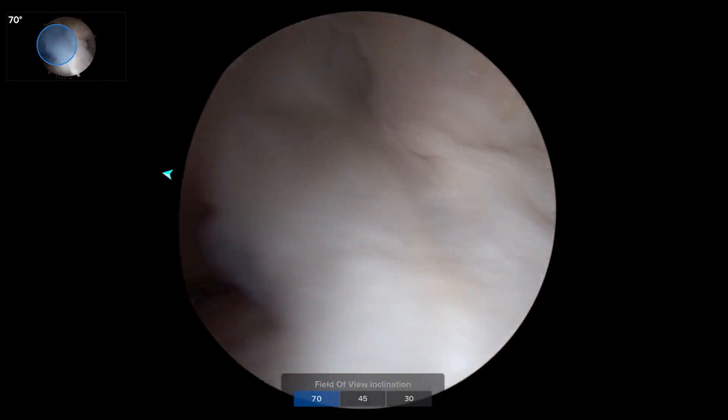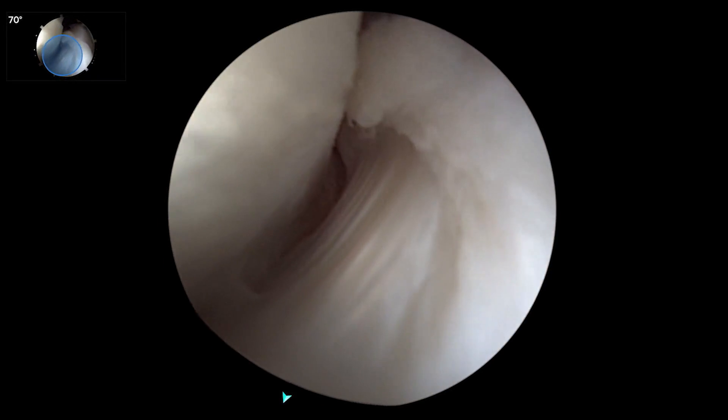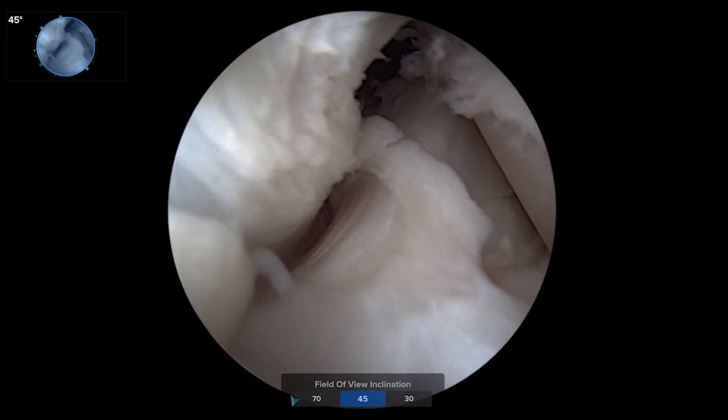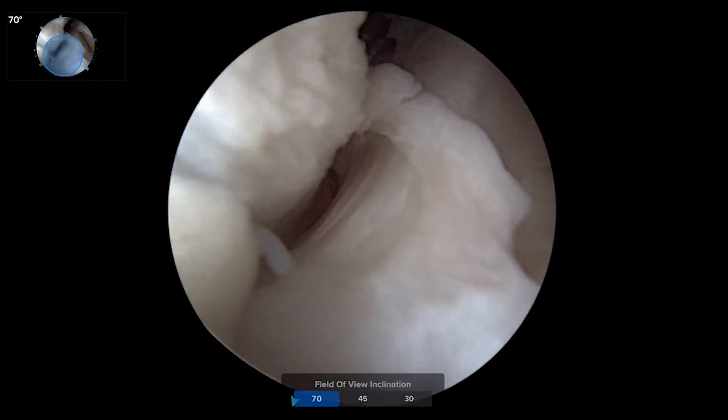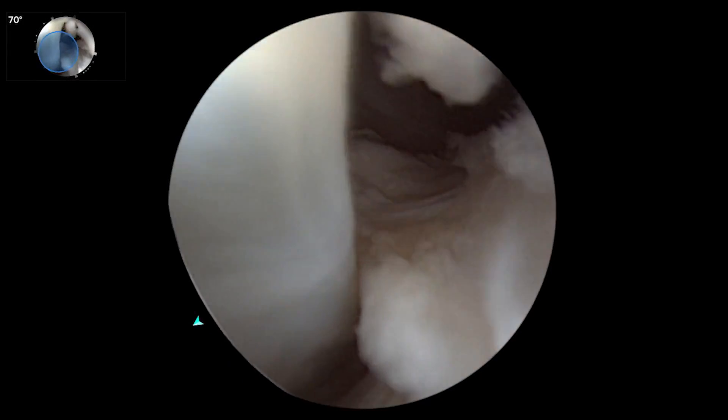With the 70-degree scope, I found it just great for looking at the PCL insertion — a very difficult view to see. This is where it would have been at 30 and 45. You get back to the 70, and it's pretty easy to see all the way down the back of the tibia.